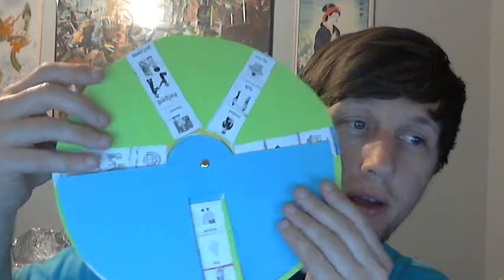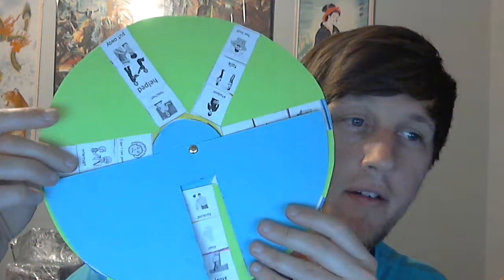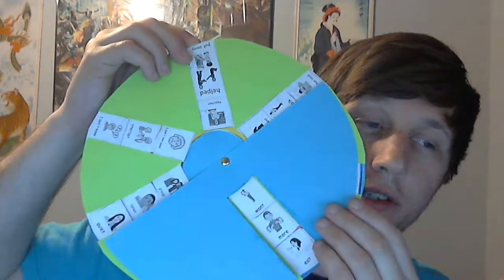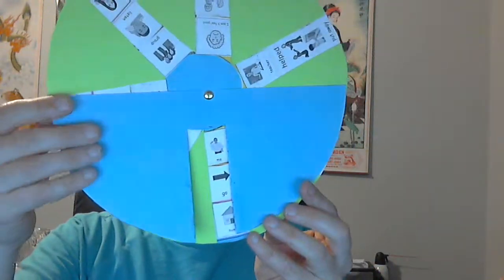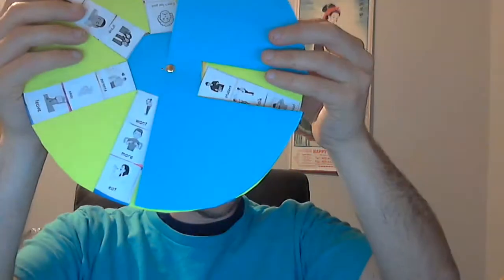I based it on something that I saw in a magazine for individuals who are on the autism spectrum, and I knew I wanted to create something like it. I didn't get exactly what I wanted out of it with how high-tech what I saw in the magazine was, but what you can see here is that I have 5 different sentences and a moving wheel.